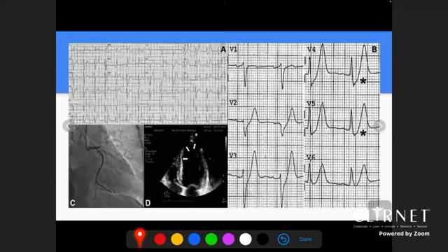And also here an advice: whenever you find a patient with severe or persistent chest pain, and the ECG is not diagnostic of STEMI, even if you don't know these syndromes, you have two or more options. First thing, you connect the ECG and keep doing serial ECGs until you find something significant. Second thing, you request cardiac troponin, but usually it will be late. So better to take the decision based on clinical findings and ECG, and don't wait for troponin if the ECG is not diagnostic.